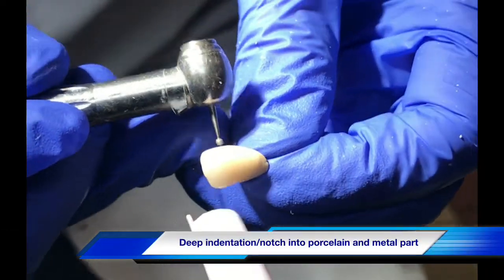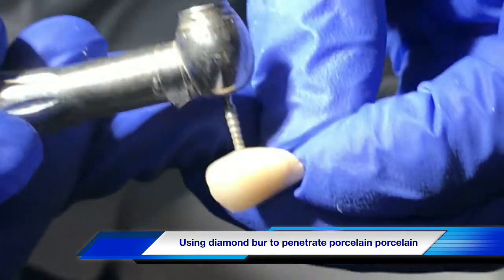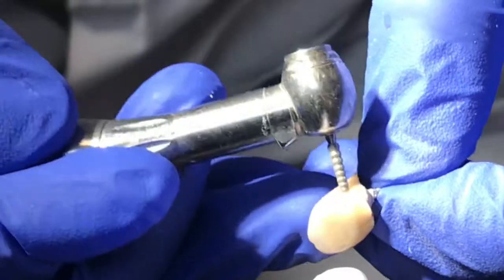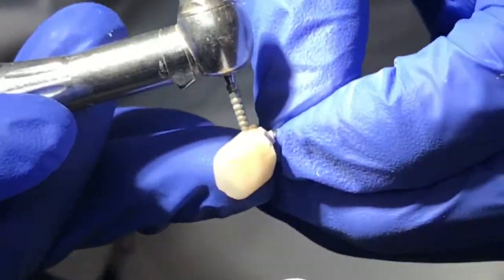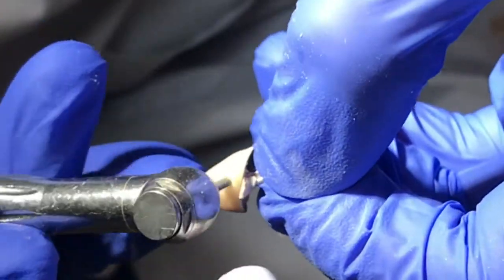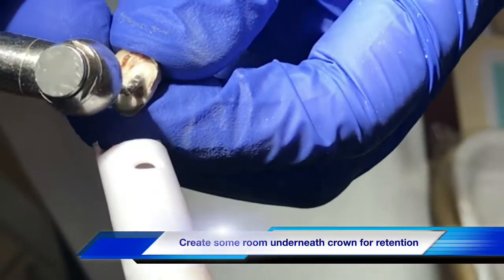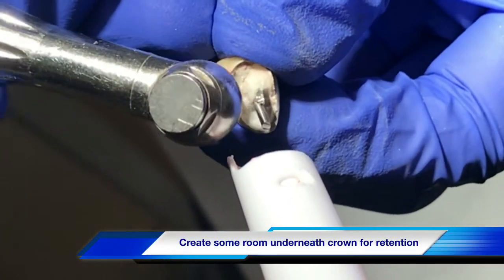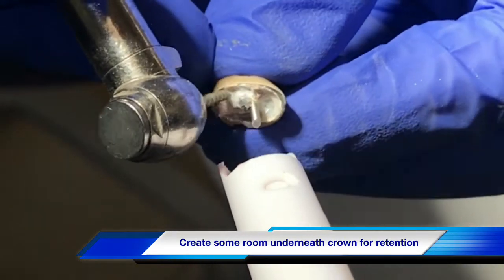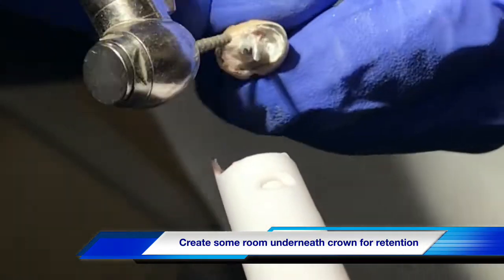Now we are creating retention from the broken porcelain crown. Using a diamond burr, we drill through the porcelain on the mesial and distal of the crown. The deeper you put the grooves, the stronger the retention you can get. You also have to be careful not to break the porcelain, because if you break it, you no longer have a tooth to do this procedure. You also need to create more room at the base of the crown from the build-up and the tooth structure that are broken inside the crown — remove as much as you can to get retention from the acrylic material.